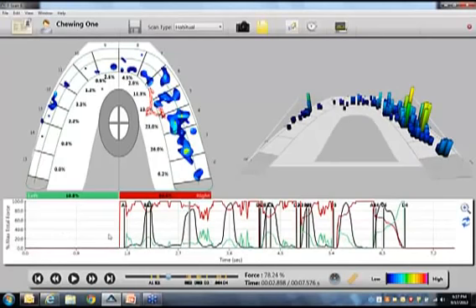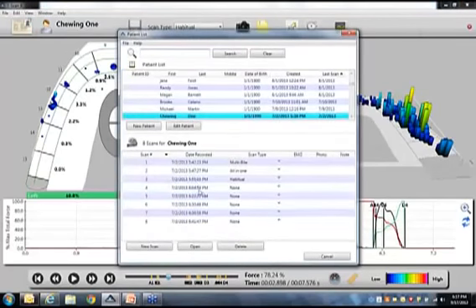So what we did, we decided to target those 2 areas right there. They were in that back part where he's feeling sensitivity. He couldn't tell us exactly where, but with the T-scan, we figured that's where he's actually feeling it, because he should have equal forces all the way throughout, like equalized group function essentially on that right side. So we did some adjustments. As you can see here, we did about 5 T-scan movies, and did a handful of adjustments in between those movies.